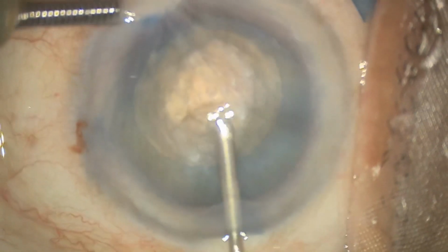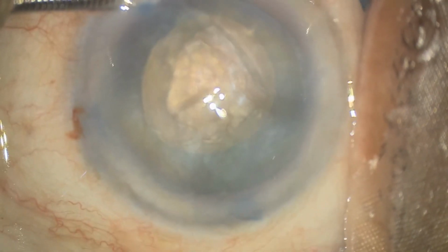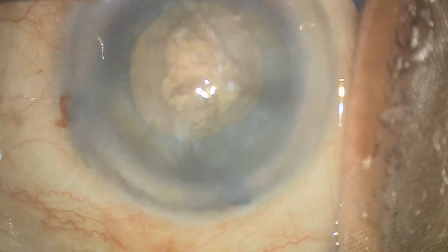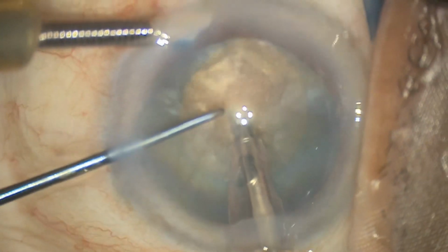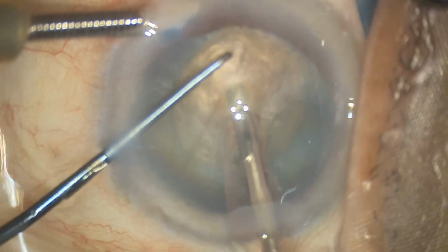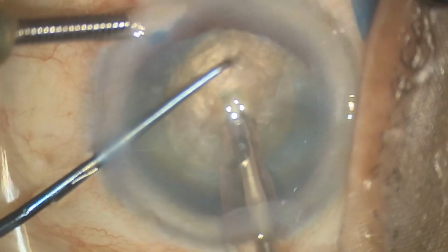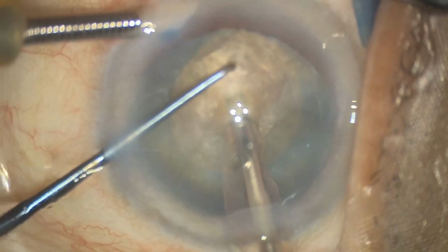This is a grade 3 sclerotic cataract, it looks white. I inject dispersive viscoelastic. I choose horizontal chop. In this case, I bury the phaco tip at a stiff angle. Once I lollipop the nucleus, I crack the nucleus.